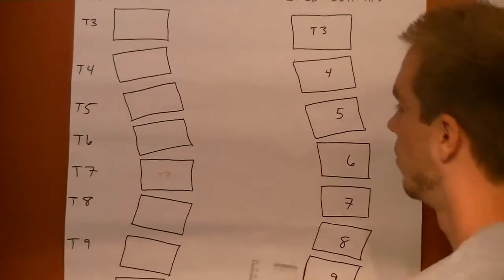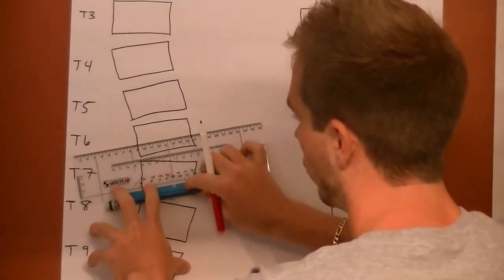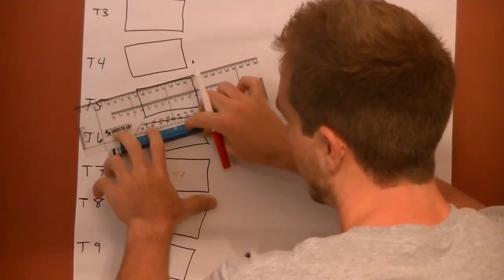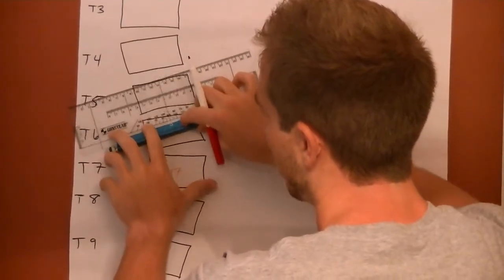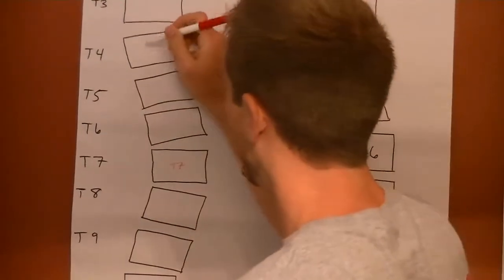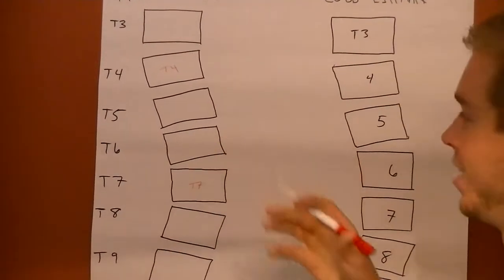From here you can move up. As you move along, you can see how the rolling ruler starts to scroll, and as it moves in this direction, it's a left-hand turn. Once it stops turning left, which would be right here, it's starting to turn back to the right, making an S bend. This is going to be your superiormost vertebra, T4, where the scoliosis ends.